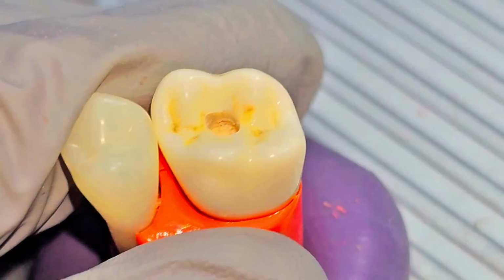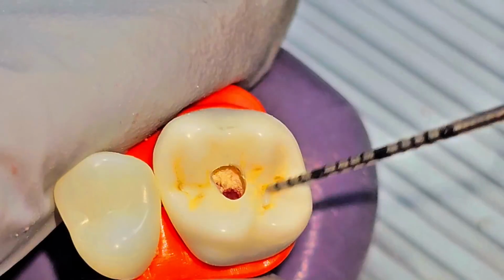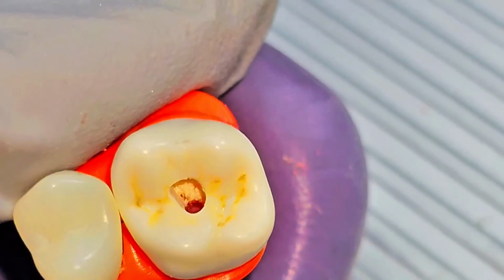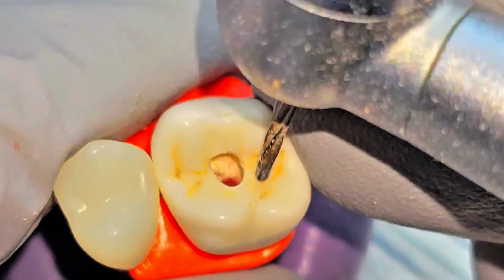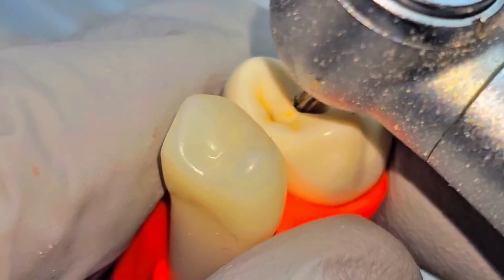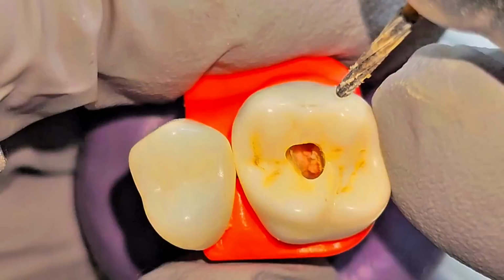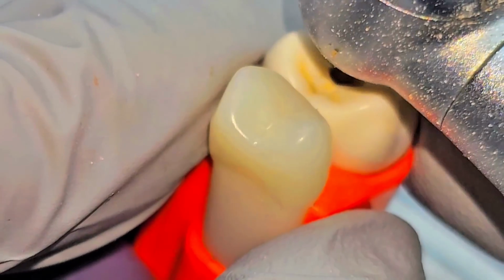It is still from the groove, it is still like 1.5 millimeter, and from the mesial-lingual cusp it is far away. And now I'm going to go a little bit buccomesially, making a straighter access prep and make it straighter.